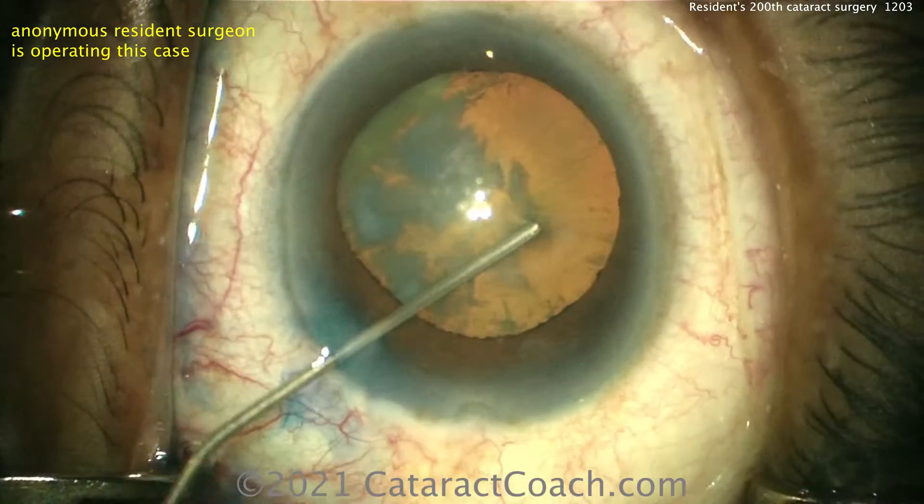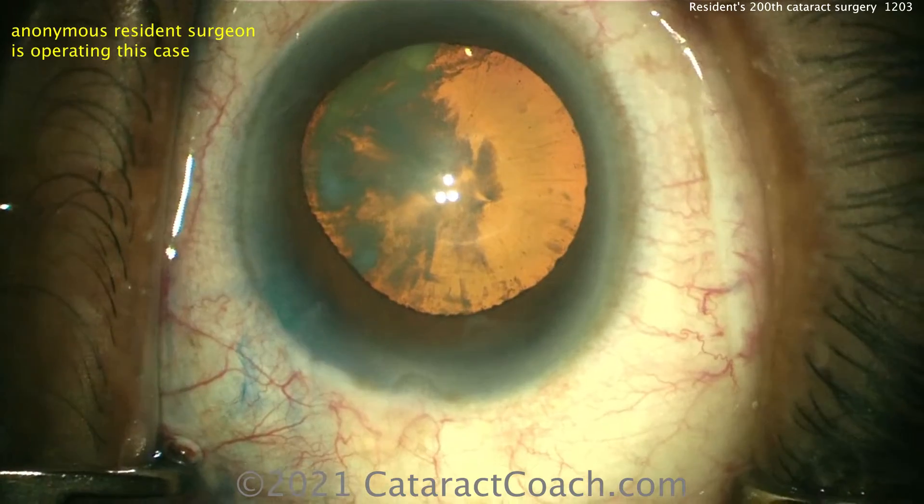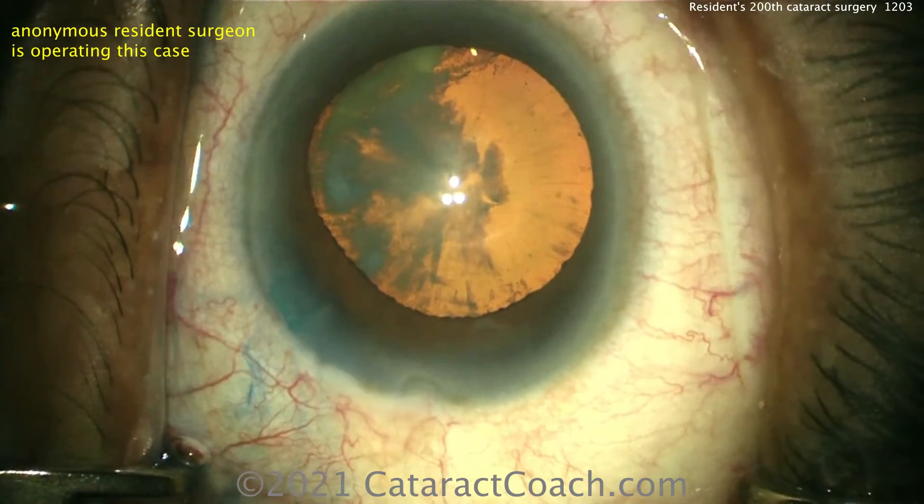The incision looks pretty good — that's a nice way of doing it. I prefer a fixation ring, but this certainly works pretty well.